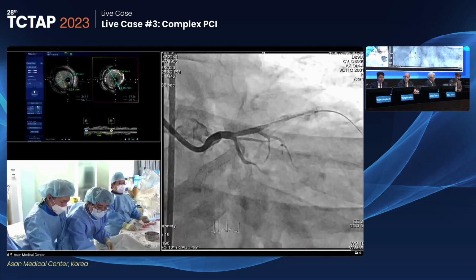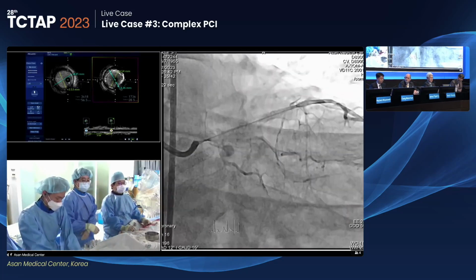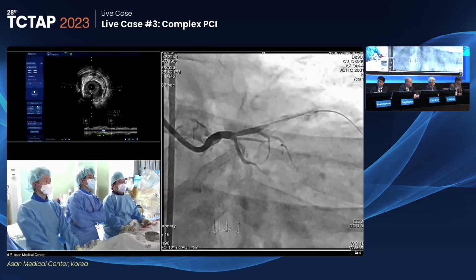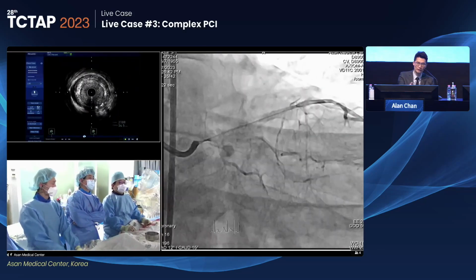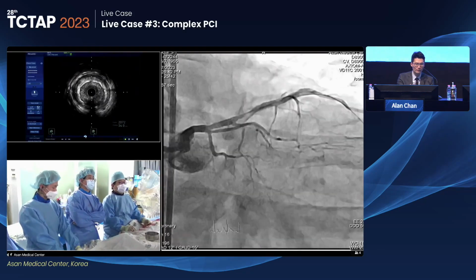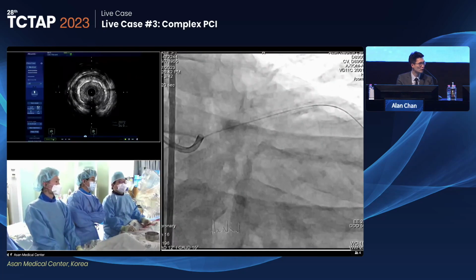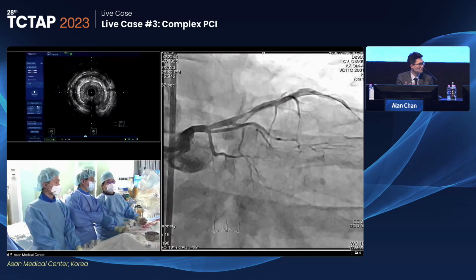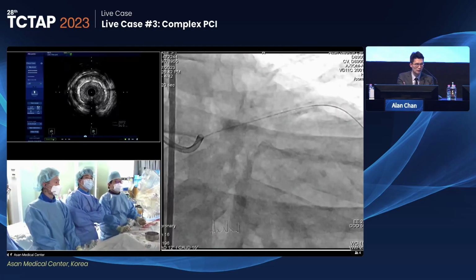The right coronary is fine despite a long stent in the CTO environment, so it could be only local. Yeah. I think it may be important to notice from the previous angiogram whether there's any geographic miss. According to the angiogram this time, there is quite diffuse, at least moderate disease starting from the distal left main all the way to the stent edge. Geographic miss is one of the reasons accounting for this rapid appearance of ISR. Otherwise, the rest of the stent is okay.